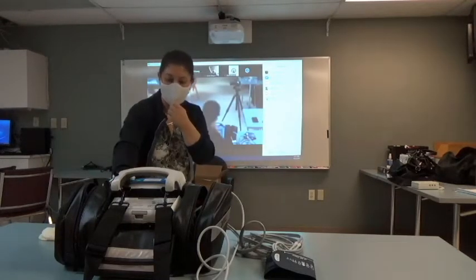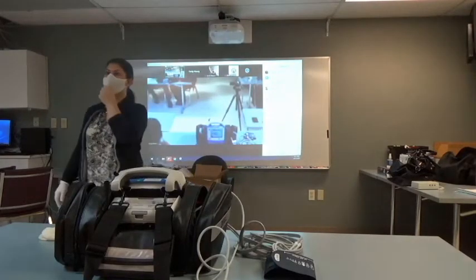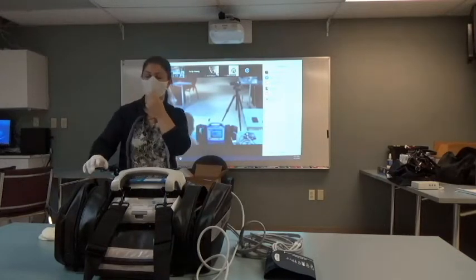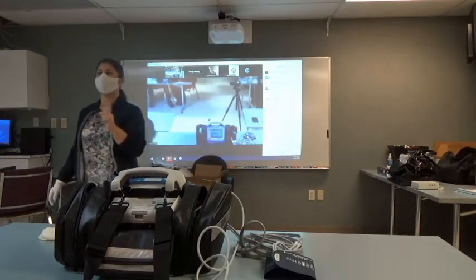Okay. If you could please, for the sake of training, go back to NIBP mode and switch it to manual. The reason we're doing that is so that it doesn't inflate and deflate during training.